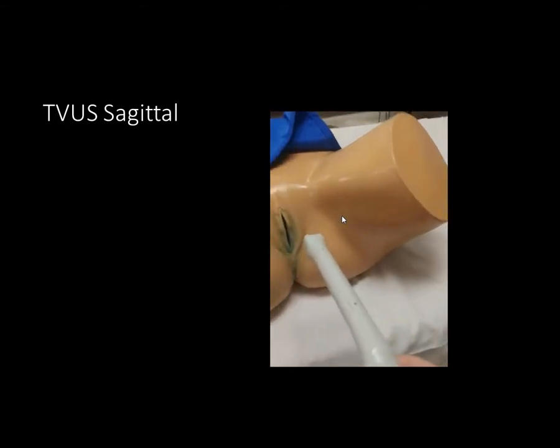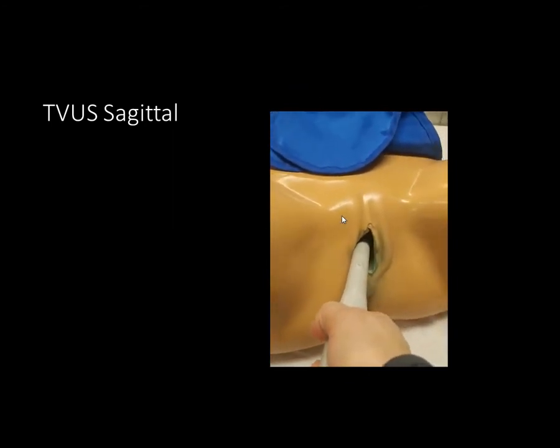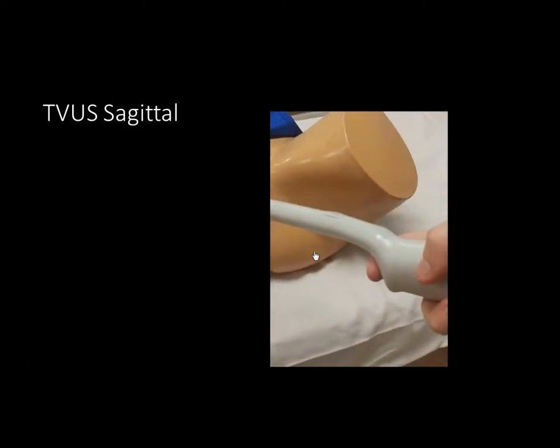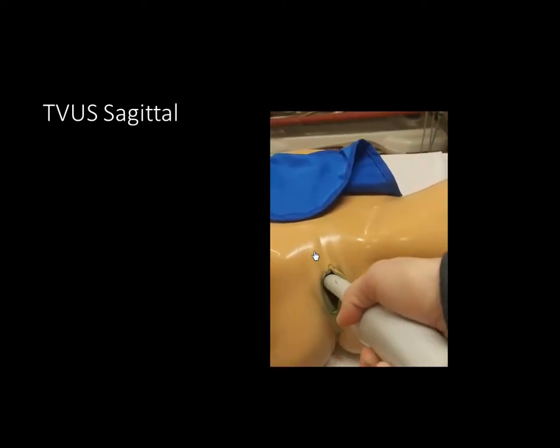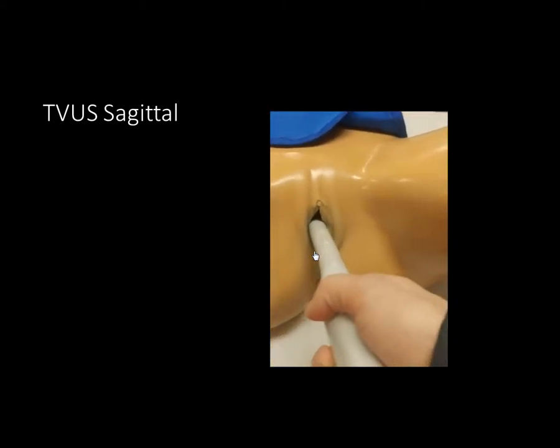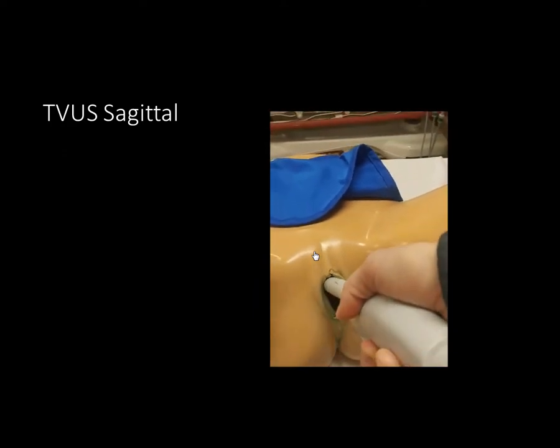For the transvaginal exam, we will empty the bladder and use the endoluminal probe. We will hold the endoluminal probe with our finger as if on a trigger of a gun. The leading edge will be facing towards the anterior abdomen. We will gently insert the probe into the vaginal vault, fan the probe left to right to interrogate the uterus in the entirety of its axis from left to right, and then rock the probe to ensure that we are interrogating the entirety of the posterior cul-de-sac. So left to right, and then anterior and posterior.